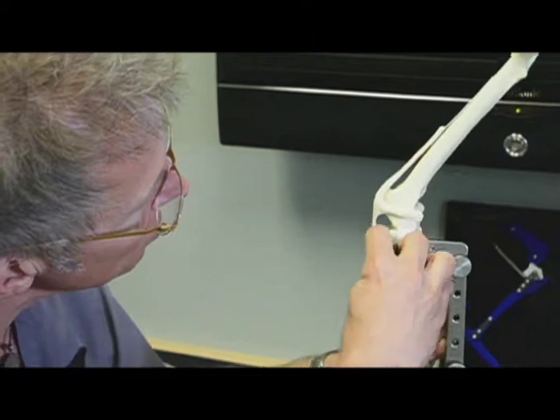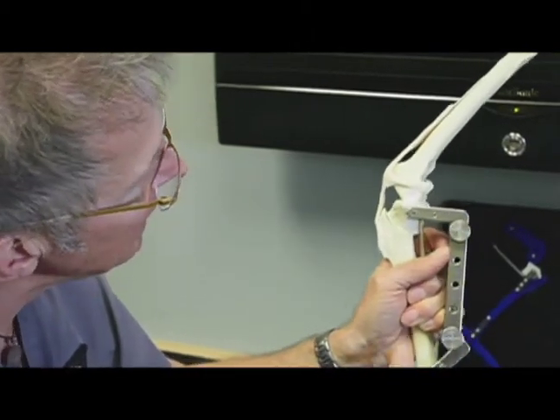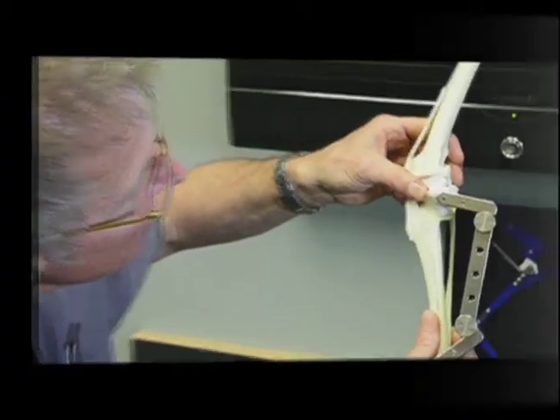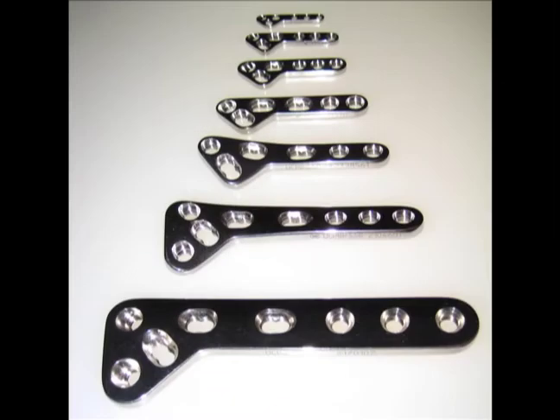The next model shows the completed osteotomy — you can see where the cut was performed and that the top section of bone can now be rotated. Based on preoperative measurements, we rotate it an appropriate amount. With it in that new level position, we fix it in place with a bone plate. Bone plates come in a variety of sizes and shapes — also about ten different options.